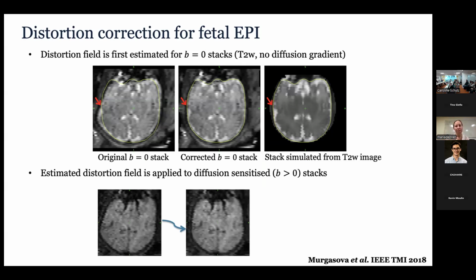So maybe, but we never really got to working on it stack by stack, so it's possible. But at 3 Tesla, we've seen such huge distortions that it was difficult to do with registration. But if the data is not too disrupted, I still think it corrects the majority of the distortion. So retrospectively, we can still correct the data if there was nothing done on the scanner.